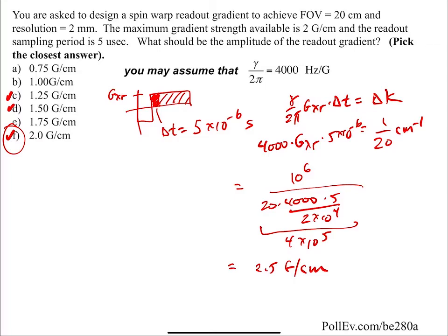So if you stated a higher or lower resolution, it might be able to do that? That's a good question. So if I enter this parameter, FOV of 20 centimeters, and the scanner goes, I can't do that, what should you do to the FOV? Make it bigger or smaller? Okay, bigger, smaller. Think about that, okay? We want to make delta K smaller, right? We want to make the area smaller, right? So FOV's got to be bigger.